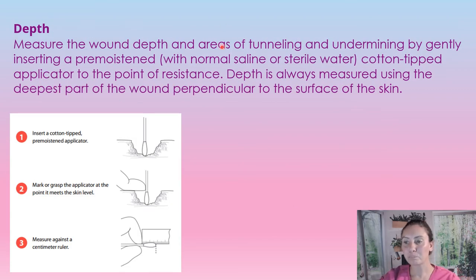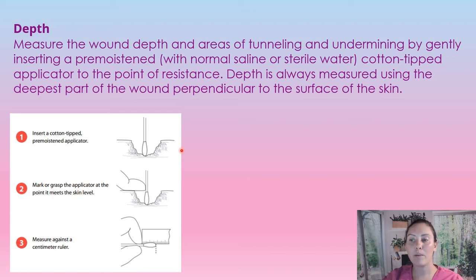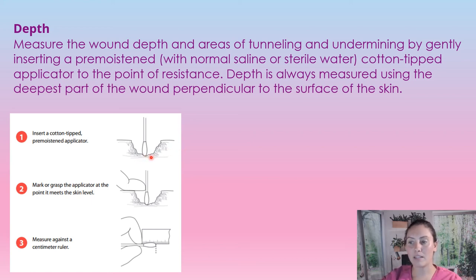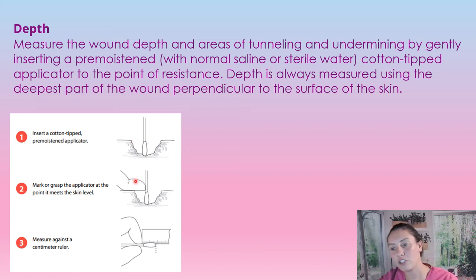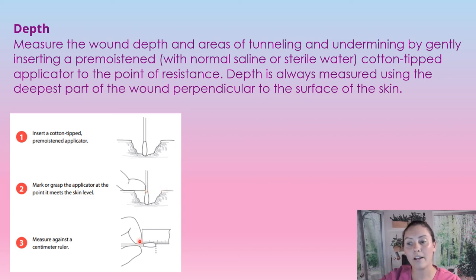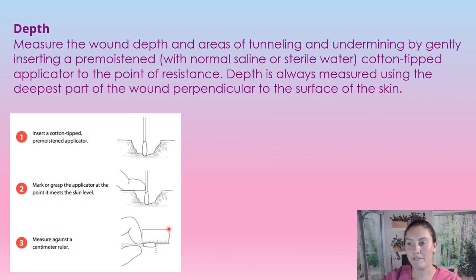To measure the depth, you insert a pre-moistened cotton tip applicator — moistened with normal saline or sterile water — just to the point of resistance, into the deepest part of the wound. Hold it perpendicular to the surface, then place your fingernail right across that spot. When you take it out, put it against your measuring tool, and that's how you find the exact measurement for the depth of the wound.